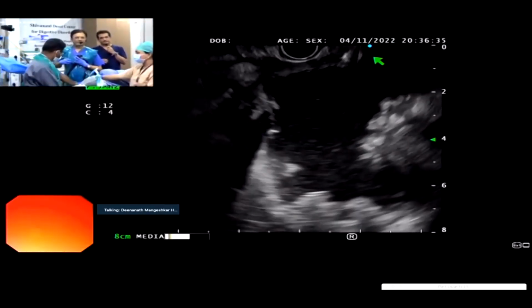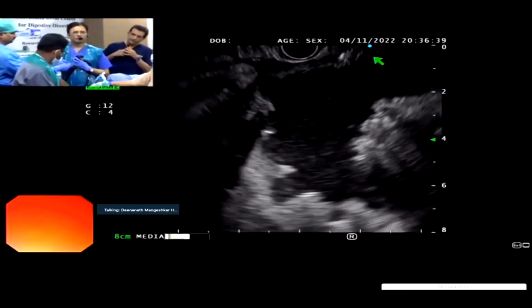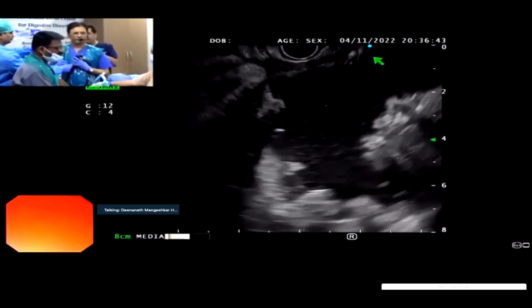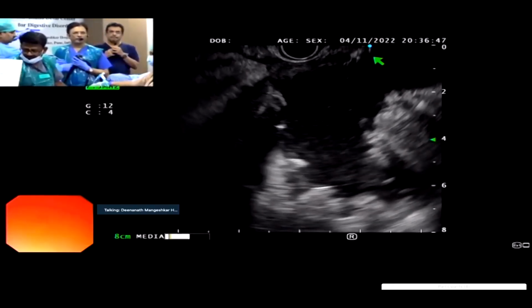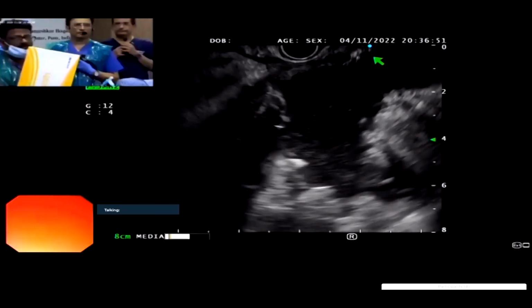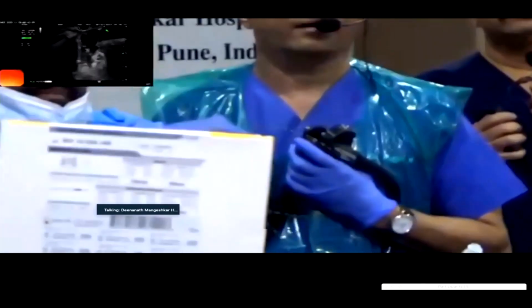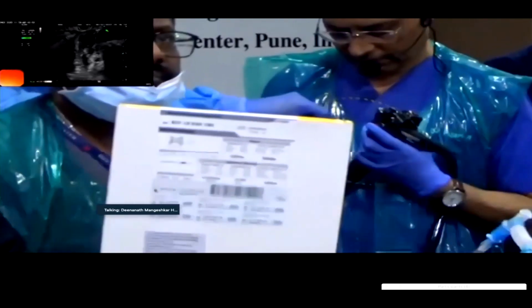So the other assistant has kept the stent ready now. Which stent are you going to use, Rajan? I am going to use a Niti-S stent, MITech, 3 centimeters in length, end to end, and an internal diameter of 1.8 centimeters. This is the wire. You need to maintain this vision all the time throughout the procedure.